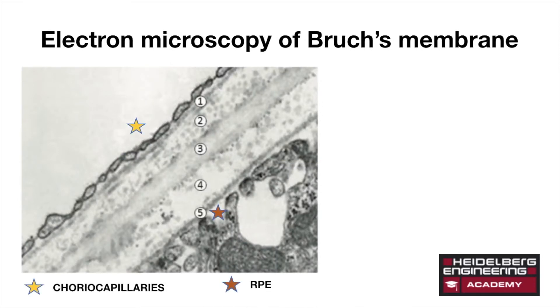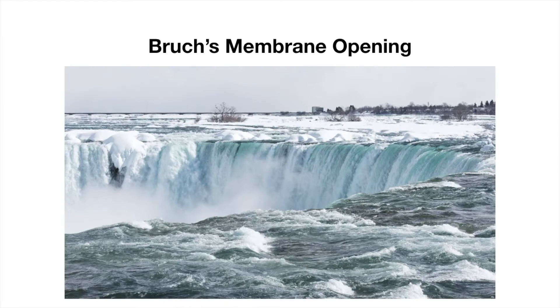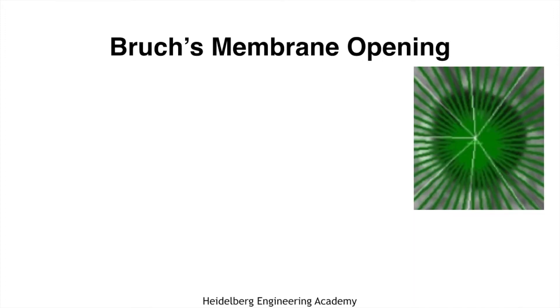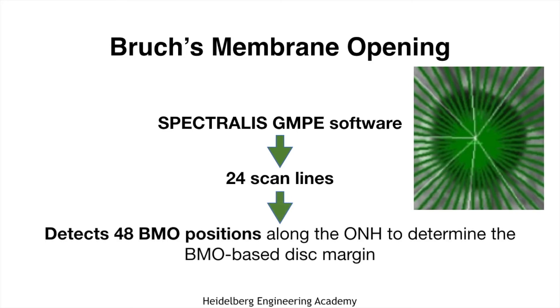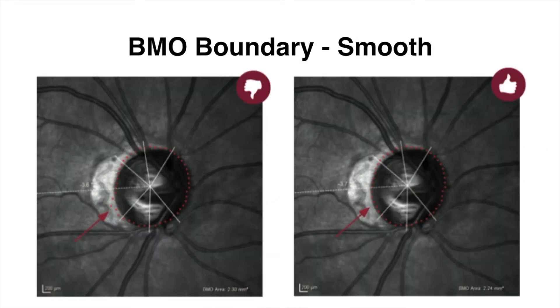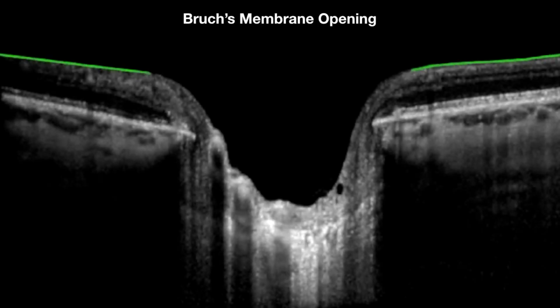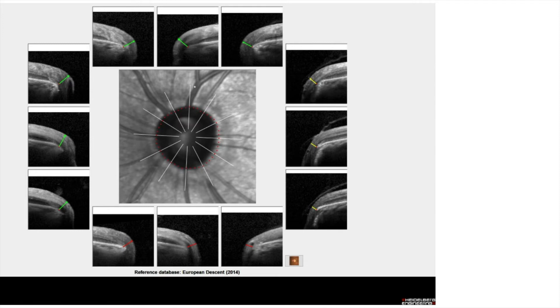Bruch's membrane opening: imagine the retinal nerve fibre layer projecting into the optic disc like water falling into a waterfall — this helps in understanding the concept better. With the Spectralis Glaucoma Module Premium Edition software, there are 24 scanned lines, so a total of 48 BMO positions are detected along the optic nerve head to determine the BMO-based disc margin. The BMO-based disc margin should be smooth; irregular margins indicate an erroneously performed test. The green line segments the internal limiting membrane, and the red line segments Bruch's membrane, with the BMO depicted as a red dot.